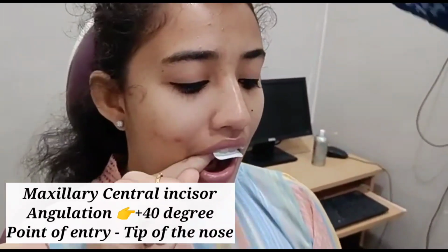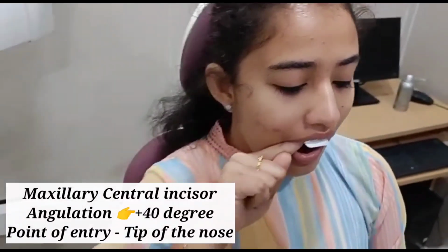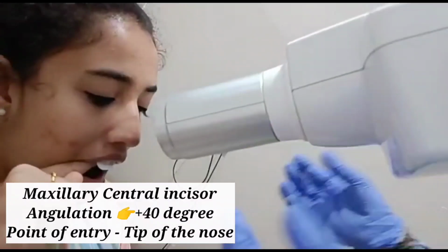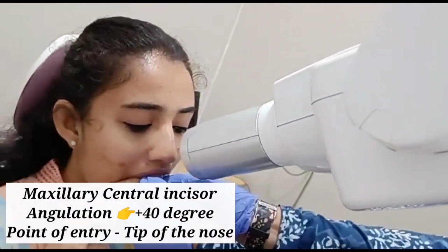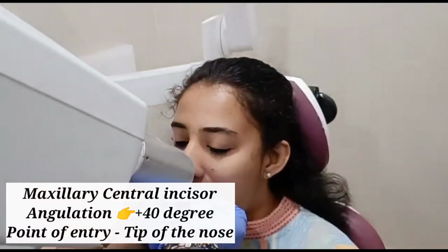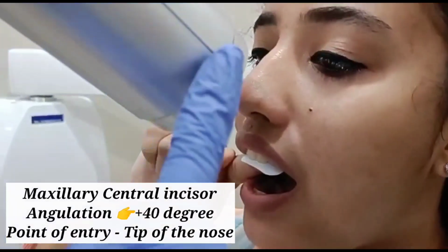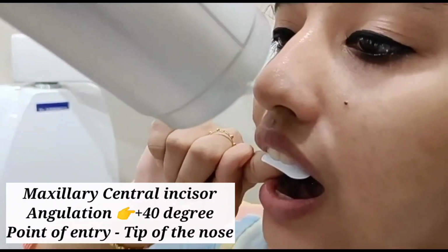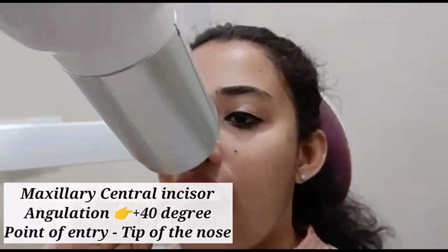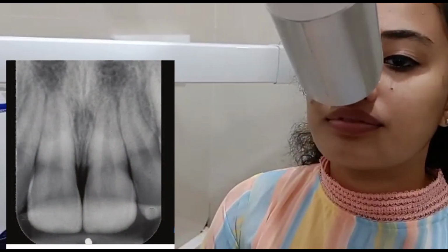And then you can notice that you have to place the X-ray tube head such that the central ray is pointed, and the point of entry is supposed to be through the tip of the nose. We are adjusting it accordingly so that the projection of the central ray is around 40 degree angulation, and the horizontal angulation is 0 degrees. And we are placing the point of entry of the X-ray at the tip of the nose. So this is how we take the IOPA for the central incisors.